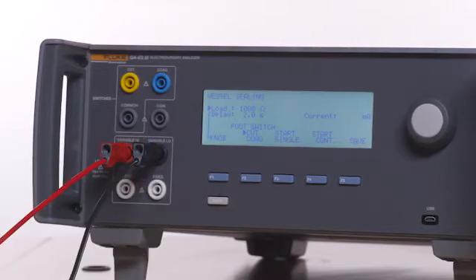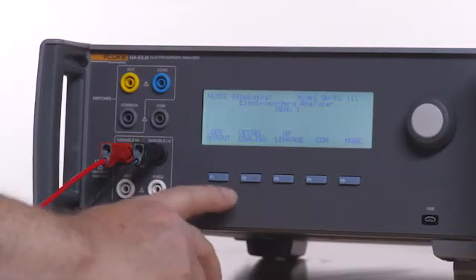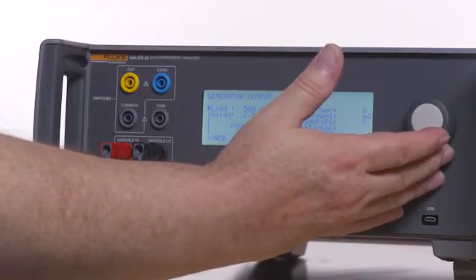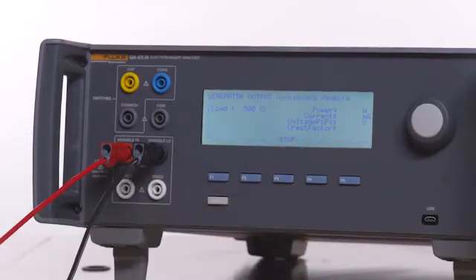Press the Back button on the QAES-3 and then F1 for generator output. Select 500 ohm load. Press F4 for start continuous.